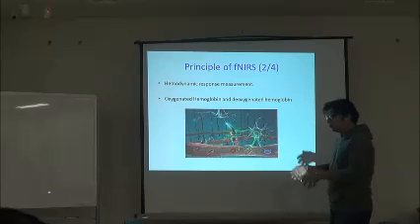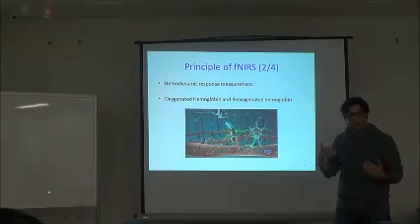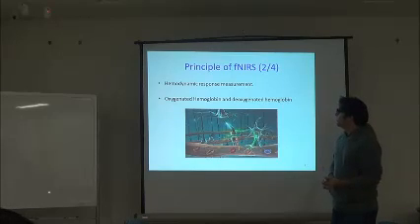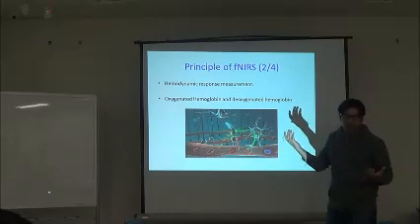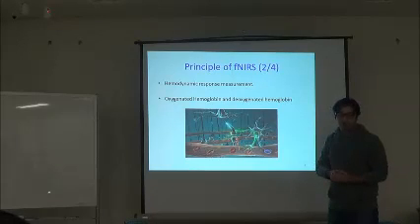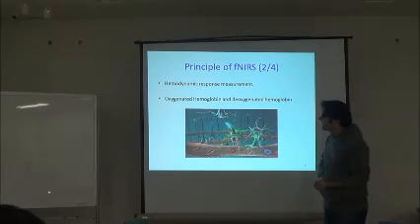Now I will tell you that once we have penetrated the light inside the human brain and it has been detected, what does it detect? It detects the hemodynamic response, as I told earlier. Hemo literally means blood, and dynamics, you all know, is movement. So the blood dynamic response means the changes in the blood flow and the changes in the concentration of the things that are present in the blood.